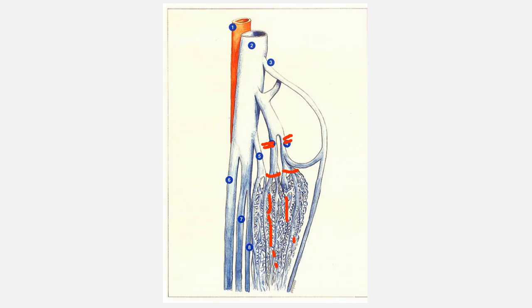Now, also look at these down here, right? If you're scanning it a little bit lower, here or here, you might also pick up, oh, what's that? Oh, what's this? Oh, what's that? So the lower into the calf you go, the harder it is to find and differentiate. You want to either stay at the ankle or up towards the knee, where you can see everything converging and separating from each other. I promise it will make sense once we learn to scan it.